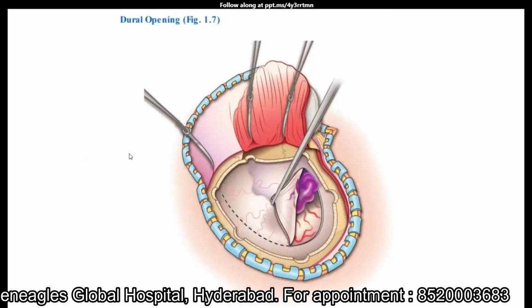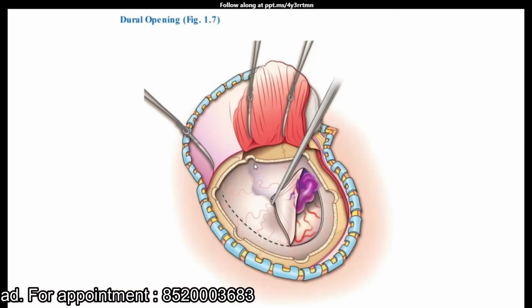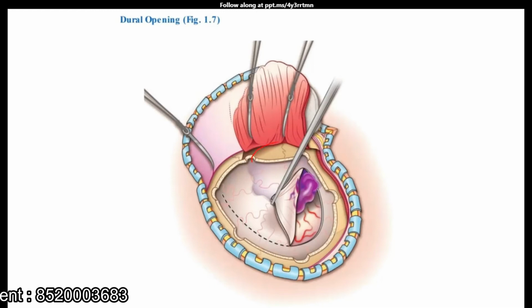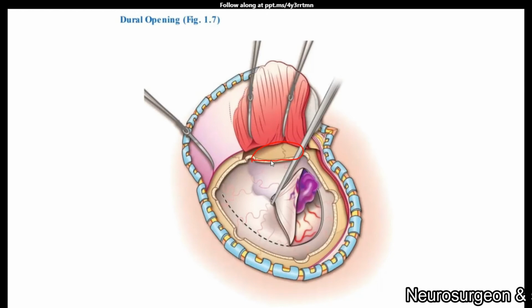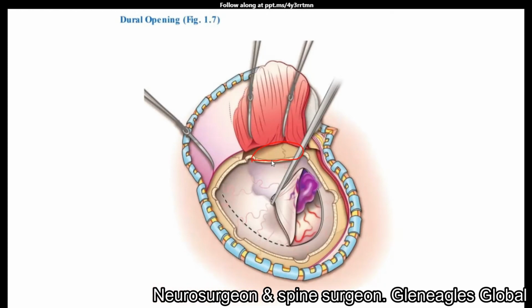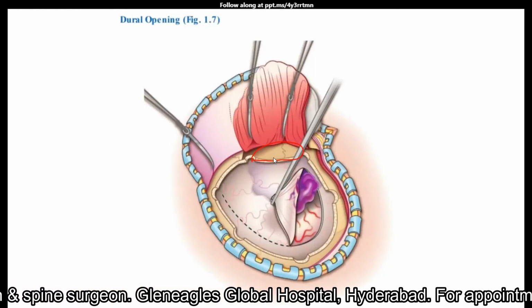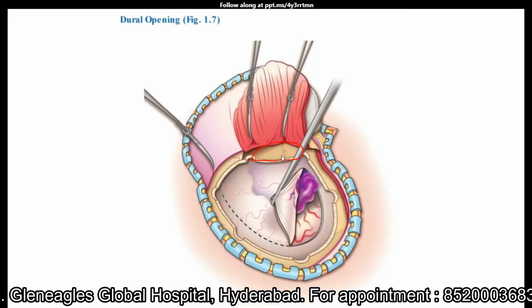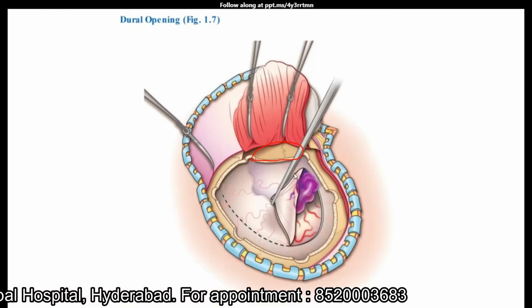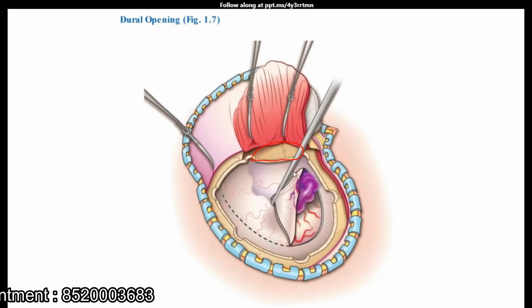Once the epidural hematoma is evacuated, if there is a lot of cerebral edema, you also do a temporal craniectomy the way we do for decompressive craniectomy. You can watch my earlier video regarding decompressive craniectomy, how we perform this temporal craniectomy. But this temporal craniectomy, in my experience, is required in the majority of cases because acute subdural hematomas are associated with widespread edema. Then I open the dura mater.